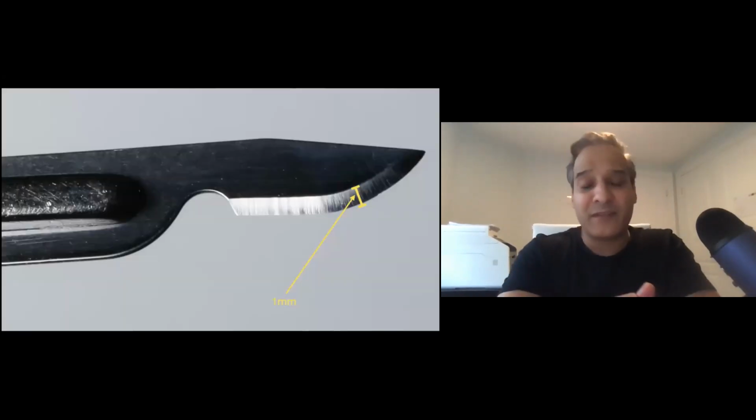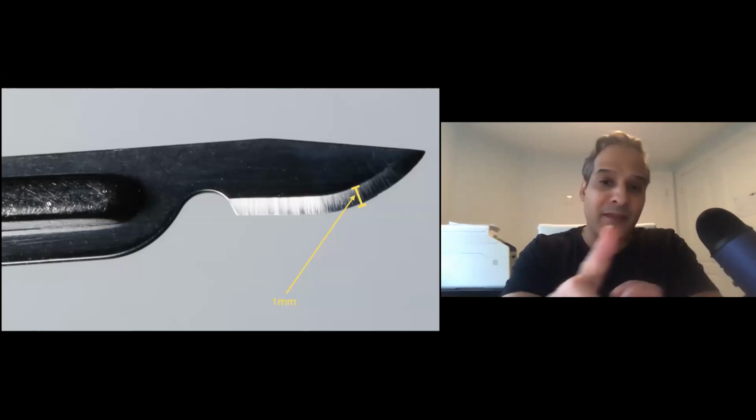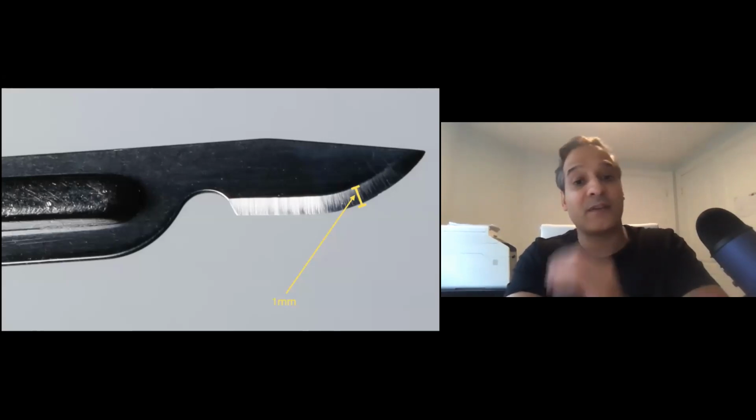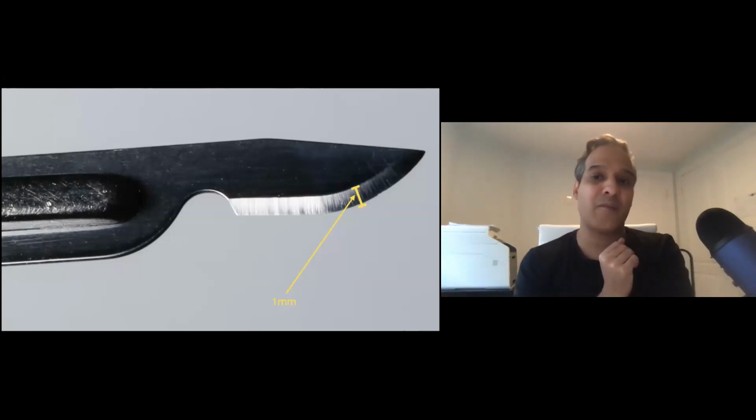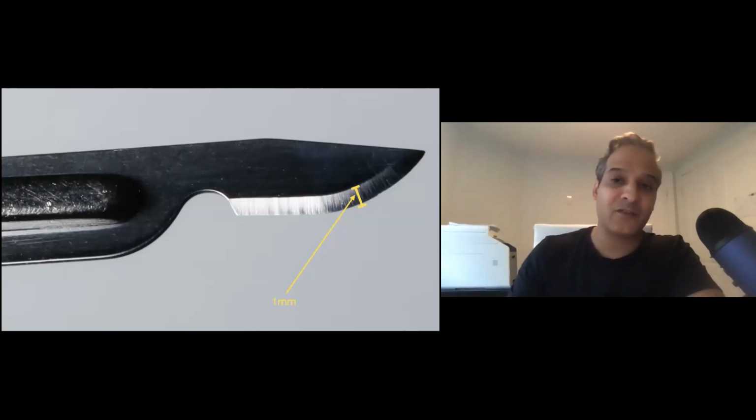Another trick with this is to use your blade. Normally, the bevel on the blade is about 1 millimeter long. So when you're harvesting a free gingival graft and cutting into the depth, you just cut to the depth of the bevel on the blade. This is an easy way to mark your way along the palate to be safe.